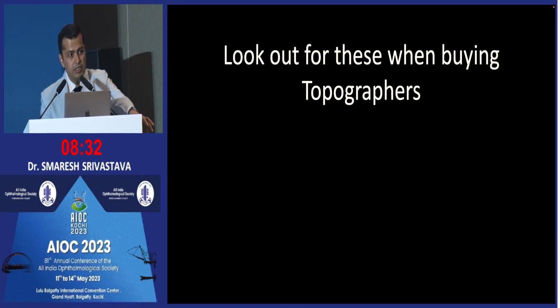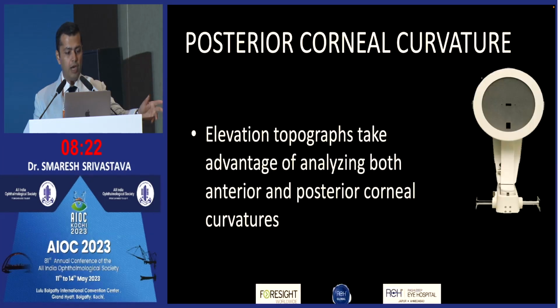But you can look out for these things when you buy topography machines, because when you go to the trade, they will tell you that our topo gives better K readings and all. But actually, topographies do also have lipid layer analysis, so it's a good idea.